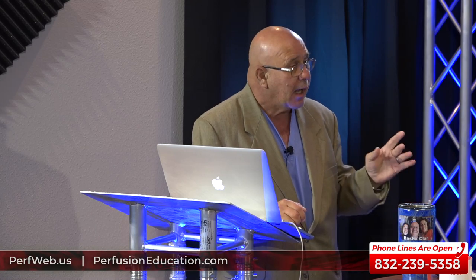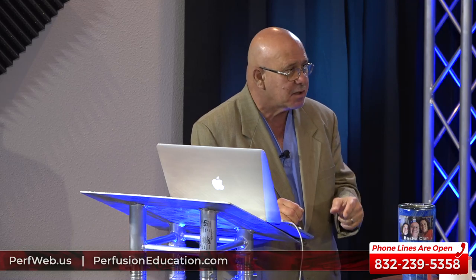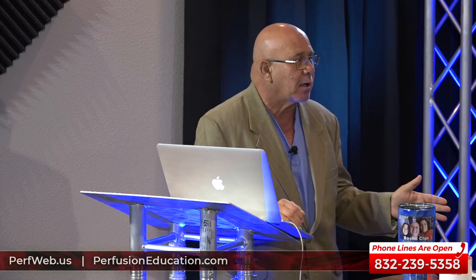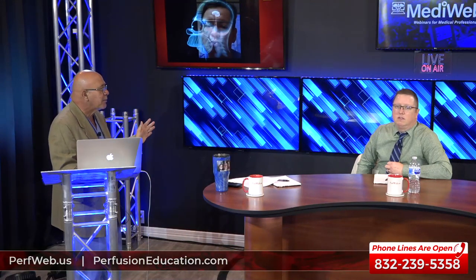The other one had to do with what you're talking about. Leave the suckers on, leave the suckers on, leave the suckers on, till they had 50% of the protamine in, and then we had to go back on pump, and the pump was clotted off. You don't have to have it happen to you very often. I've physically had it happen in my professional career, where the pump has clotted off because they left the suckers running while the protamine was being administered. No more. I won't do it.